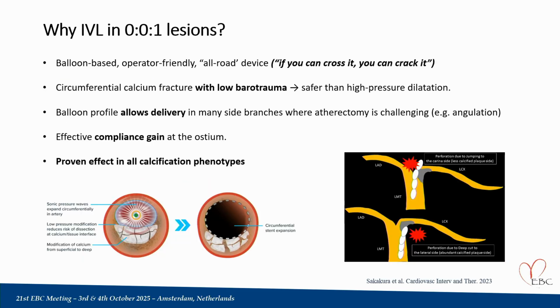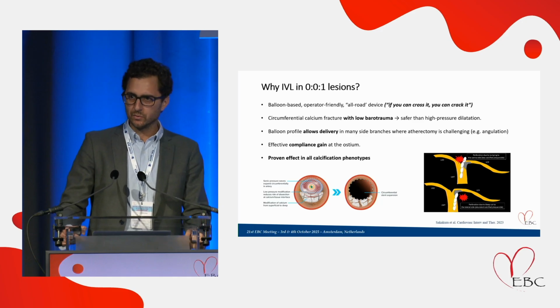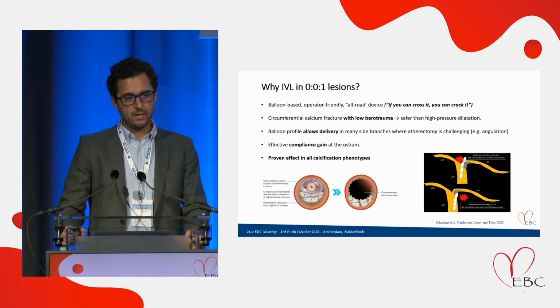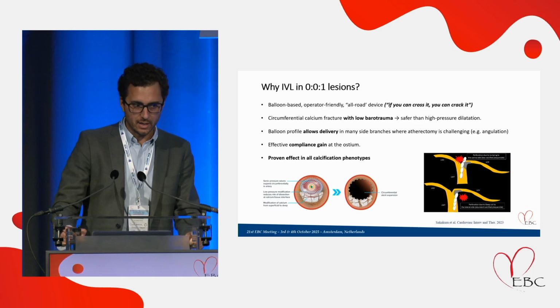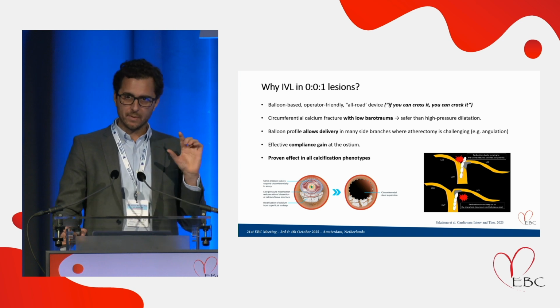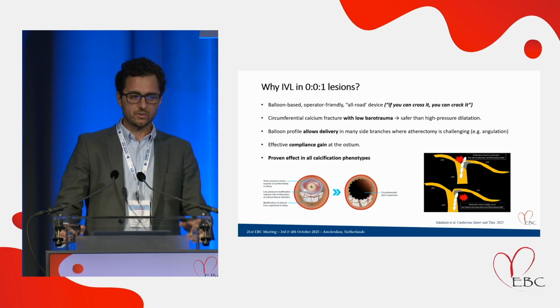So why is Shockwave, or in this case IVL, useful in 0-0-1 lesions? It has been briefly mentioned already. We're talking about a balloon-based, operator-friendly, all-road device. It's a philosophy: if you can cross it, you can crack it, right? IVL has been proven to be effective in all different morphologies and phenotypes of calcification. We are able to generate circumferential calcium fractures with low barotrauma. For those who are using this technology on a regular basis, only inflating a balloon to 4-6 atmospheres is just enough to deliver the pulses that fracture the calcification.